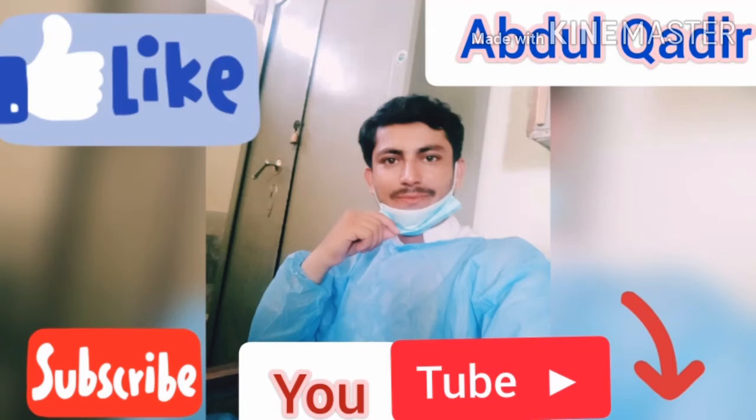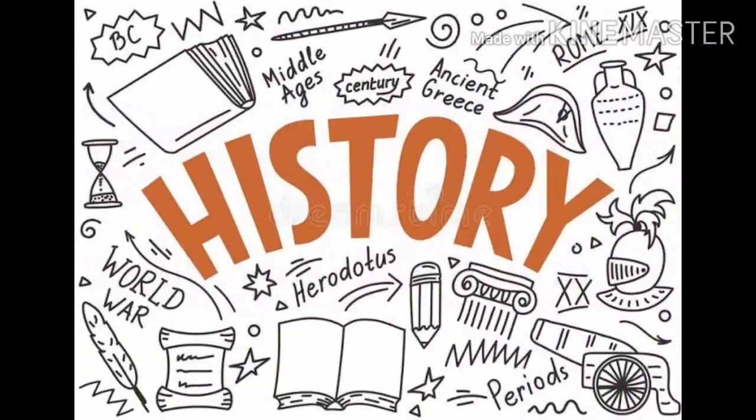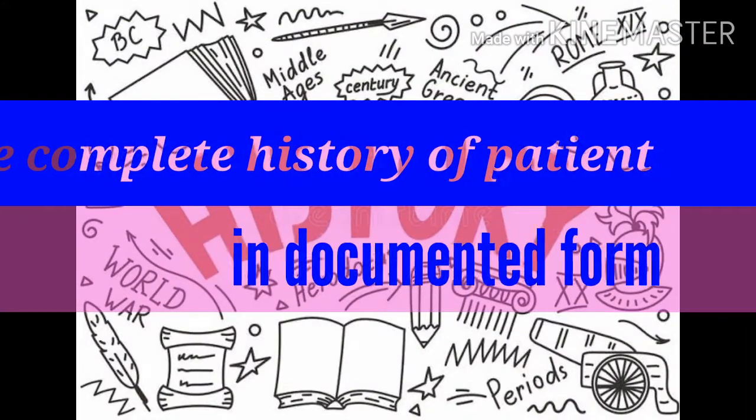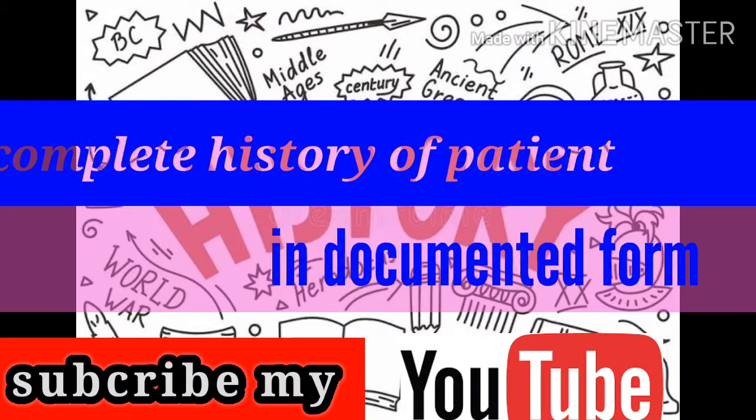Bismillahirrahmanirrahim. Today we will discuss the back slab and the complete method of applying a back slab. First of all, see the complete detail or history of fracture and document it.